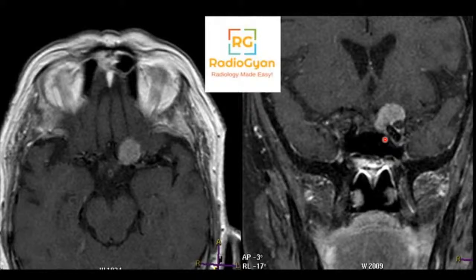Yeah, it's an interesting sign. I don't know if it's relevant from a diagnostic perspective. It's just interesting. One of those signs where radiologists have been super creative. Yeah, perfect. So it's the mother-in-law sign.